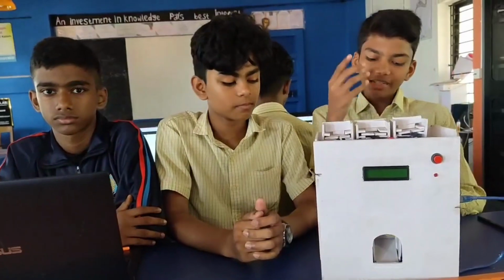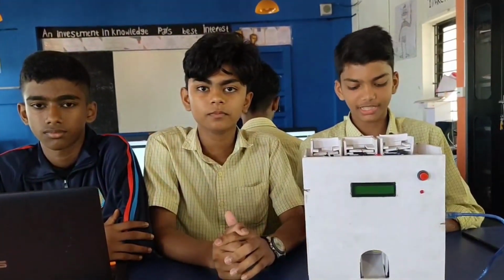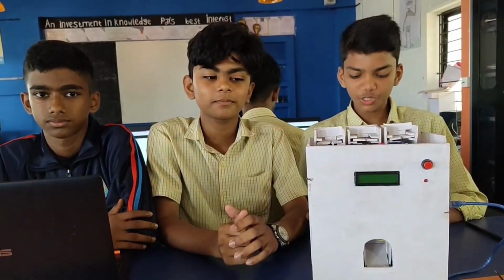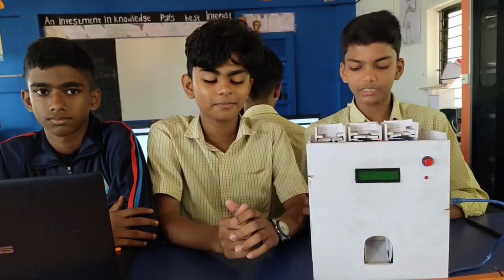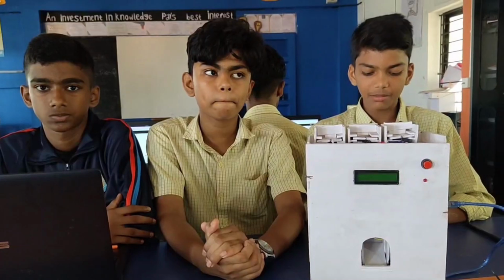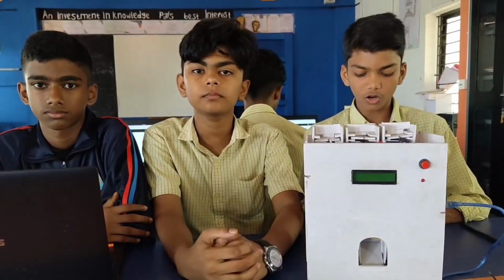Components used to build this project are: Arduino Uno, which is the brain of this project. Jumper wires are used to connect components. A 10K potentiometer is used to control the brightness of the LCD, which is another major component, to display time and the name of the medicine. And a dotted board is another component of this project.